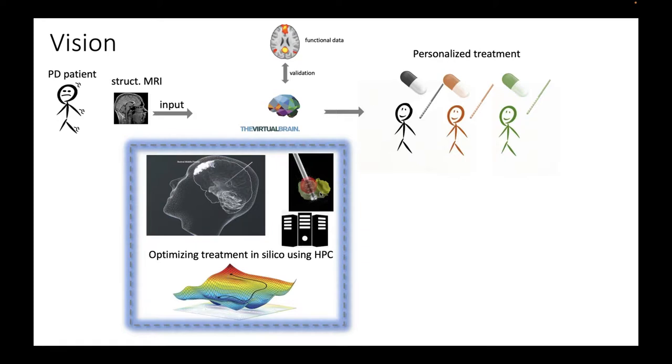And how is that done? So the patient sits, and the doctors try to find the right settings, they test out different things, but it's always a limited time in the session, right? So you will spend a couple of hours with the patient, then you will send the patient home with the best setting you think.